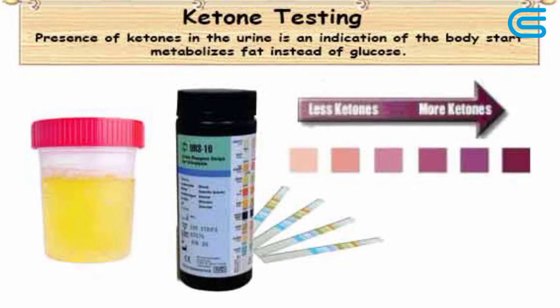Ketonuria actually is the presence of ketones in urine, and this can happen during starvation, persistent vomiting, for example in children, when children are constantly vomiting, a weight reduction program, such as when you want to reduce your weight, whereby you severely deny your body from taking in carbohydrate, hence it will switch to breaking down the fats. Increased metabolic needs, such as when children have fever, severe thyrotoxicosis, pregnancy, of course it leads to increased metabolic needs, and protein calorie malnutrition.